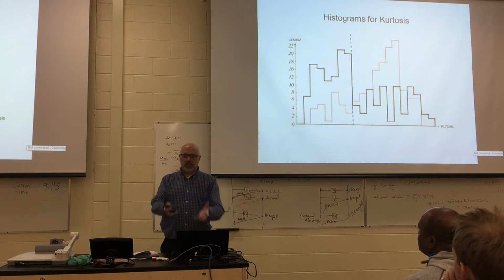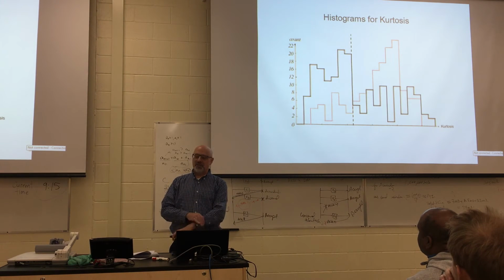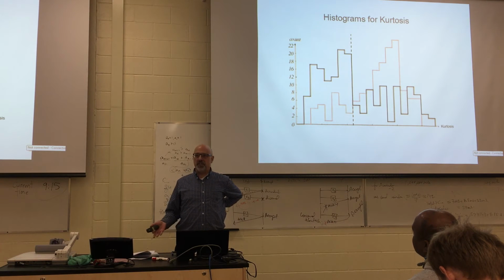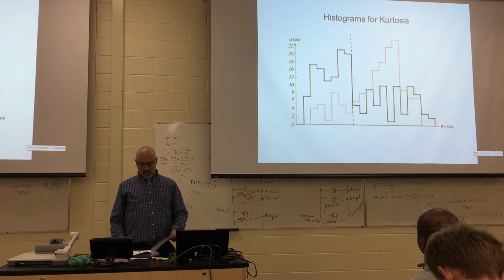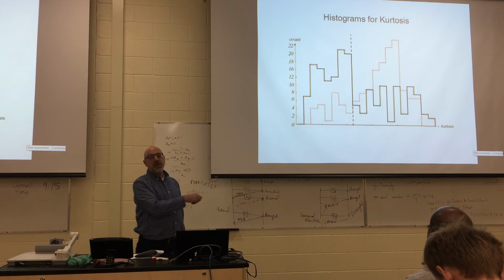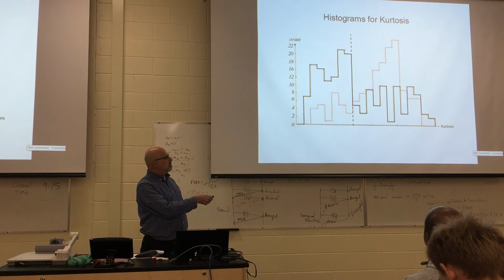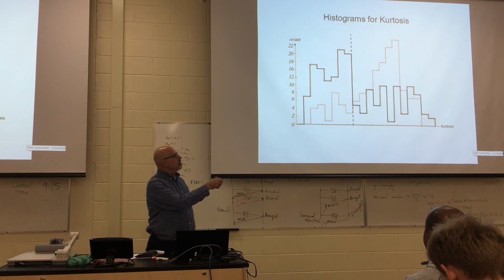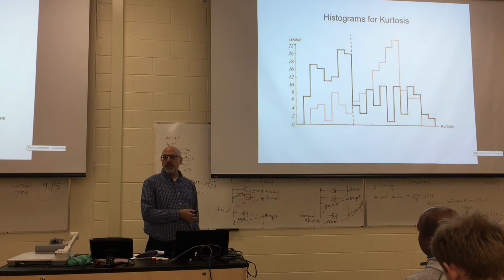So we want to build a classifier. We've collected some features. When we did this, we collected a lot more, but I'm not going to go through all of the features in one class. I just want to check the time. Here's a simple way of making a classifier for one feature: let's just build a histogram. The pink is segment number 1, which is the eye movement, and the black is the histogram for the clean segment. If we pick a threshold here and say anything to the left of this we'll classify as clean signal, and anything to the right we'll classify as contaminated signal, using these histograms as the ground truth, how well would this simple classifier work?